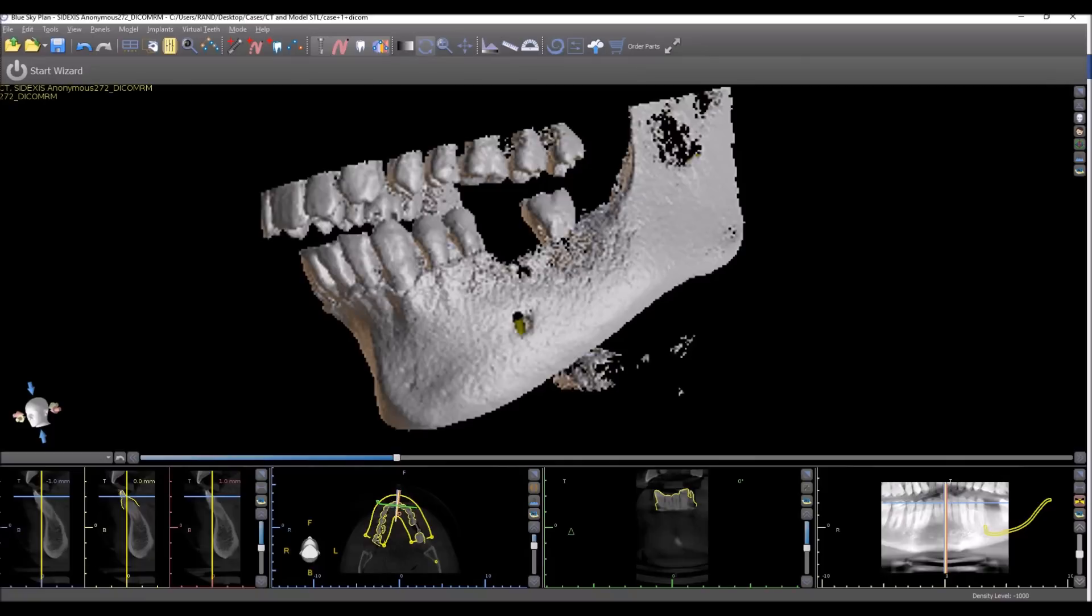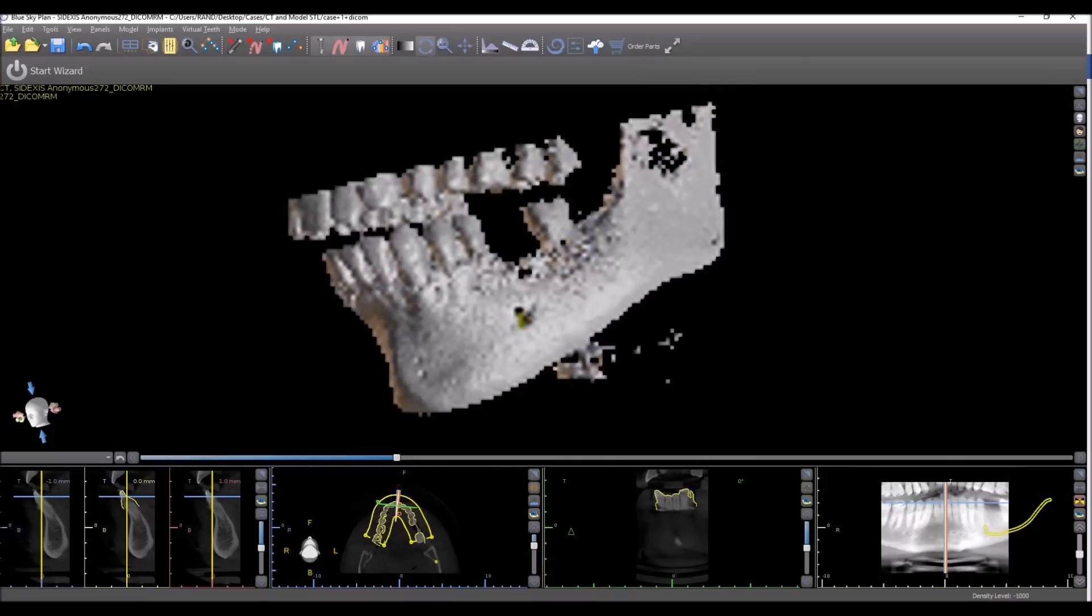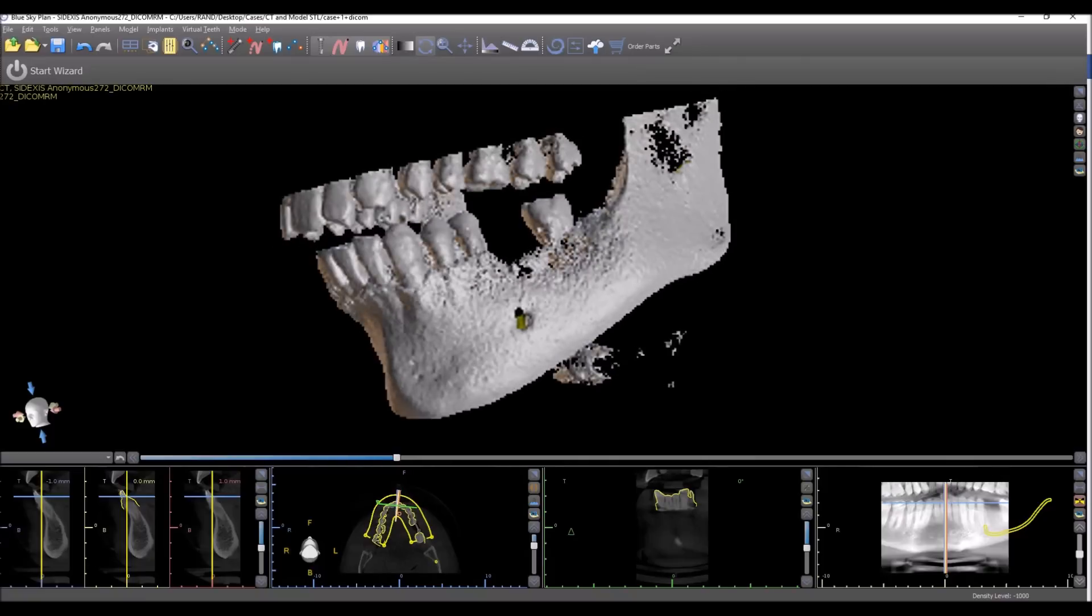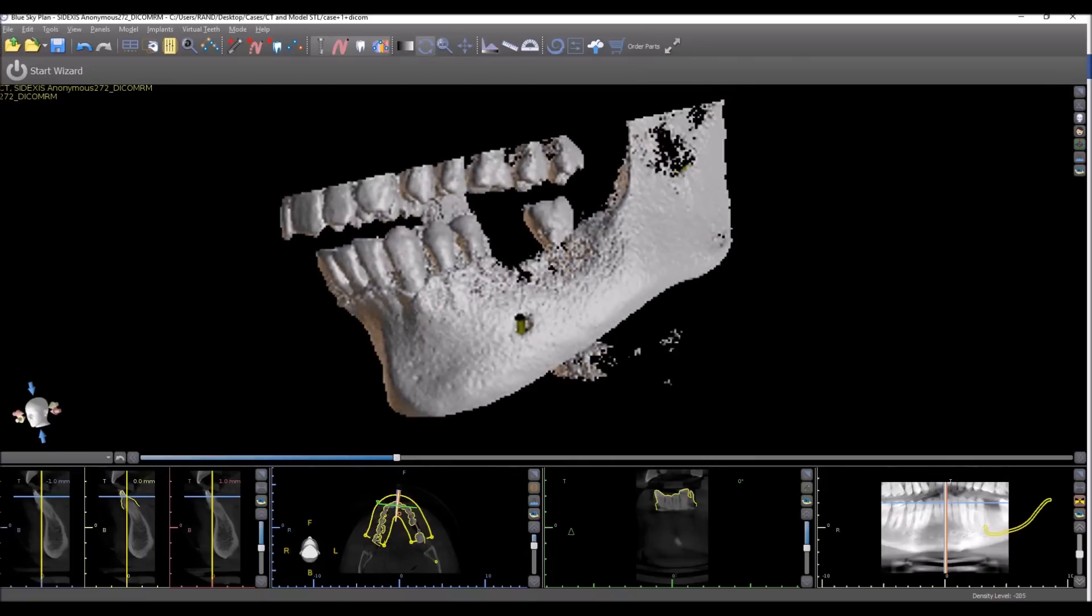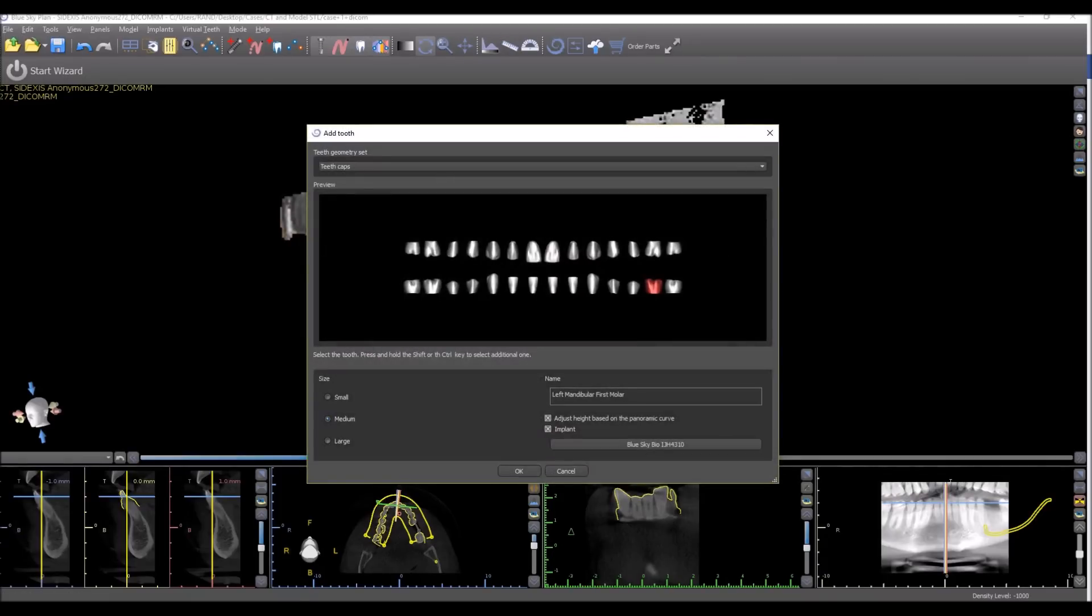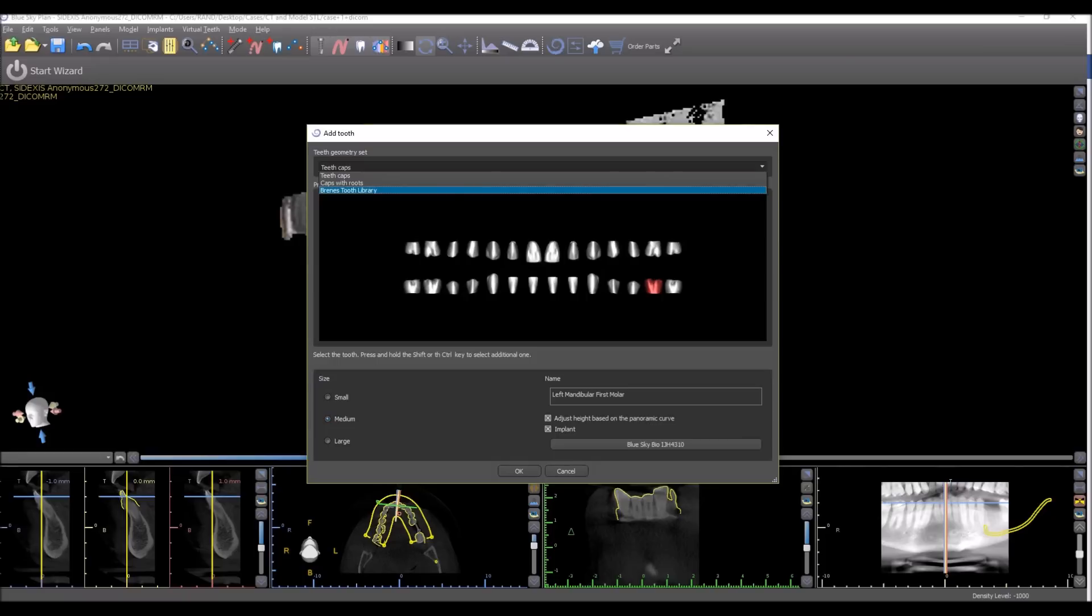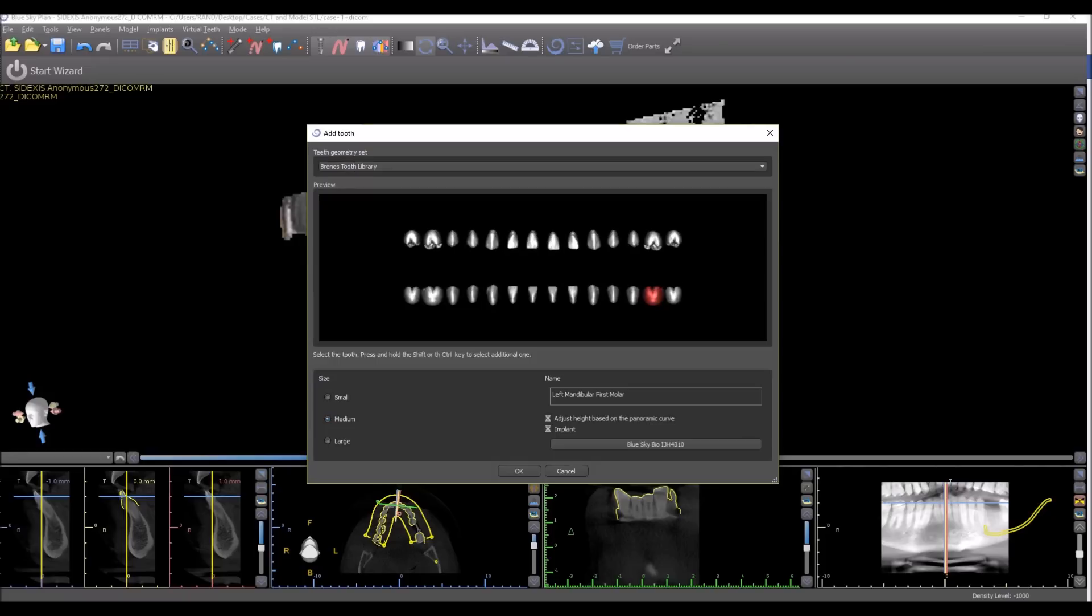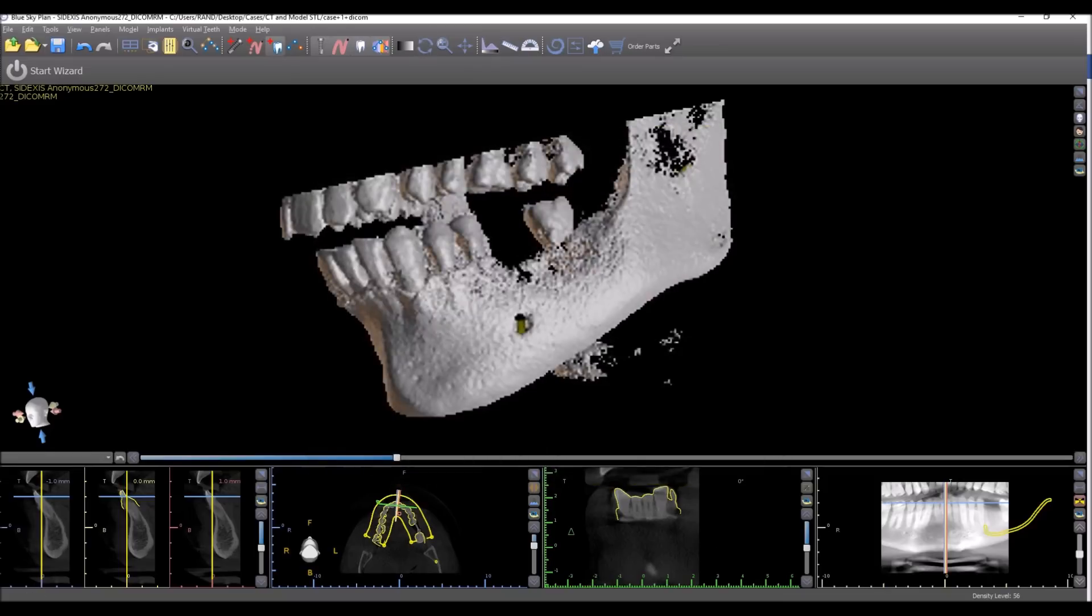Moving along, I've jumped out of the wizard, turned that off for now, but if we go ahead to add a virtual tooth, we can see that we now have, courtesy of Dr. Brennis, we now have the Brennis tooth library added to the software and the virtual teeth appear as an option and could be dropped into the treatment plan.